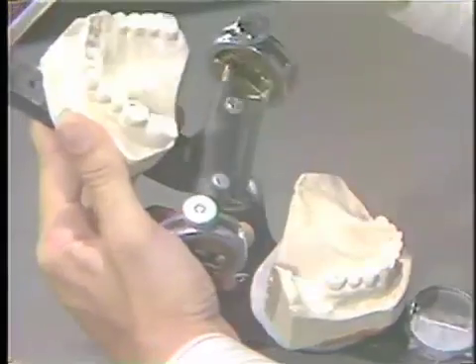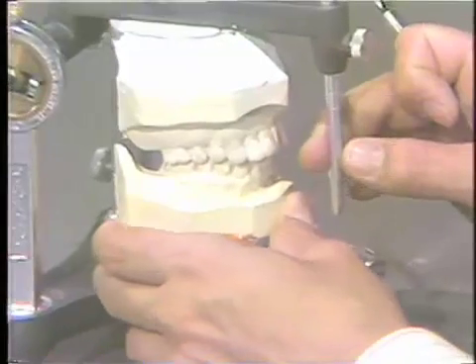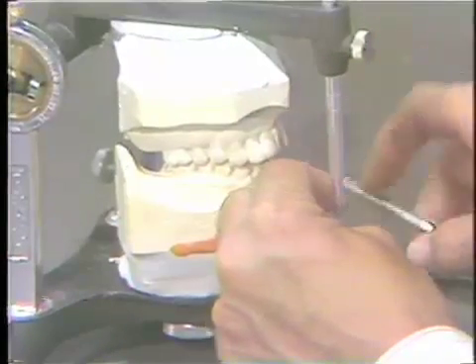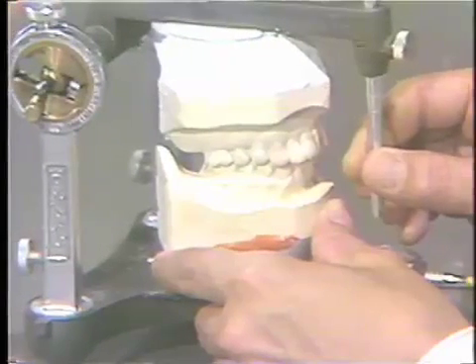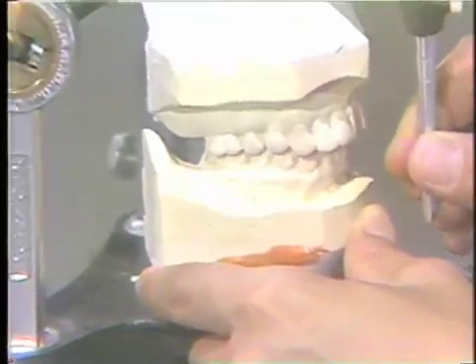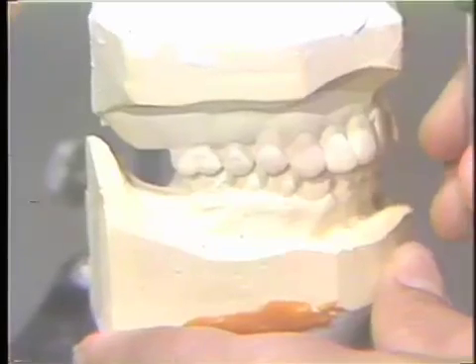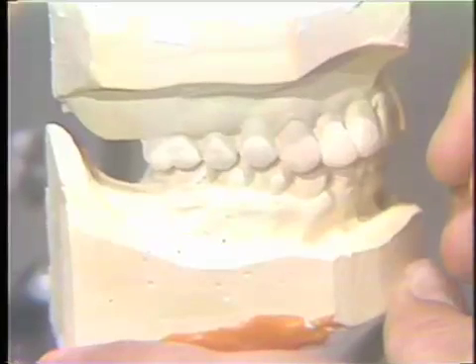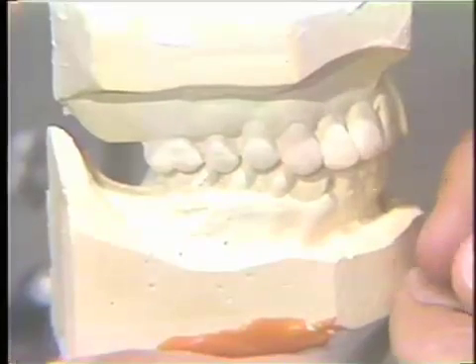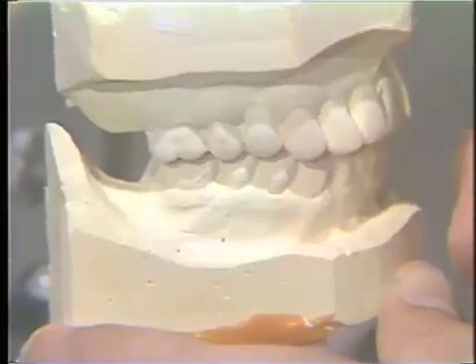When the cast is arced in the centric relation position, this is the first contact. If we then simulate the centric occlusion position and let the teeth take over and guide, we have a slide in centric on this patient. It has a vertical component to the slide as well as a lateral component. So prior to the reconstruction of this patient, we would want to eliminate this slide in its entirety.